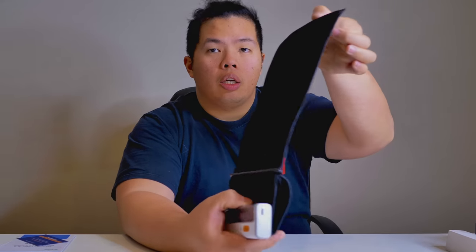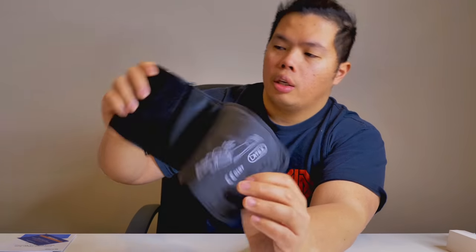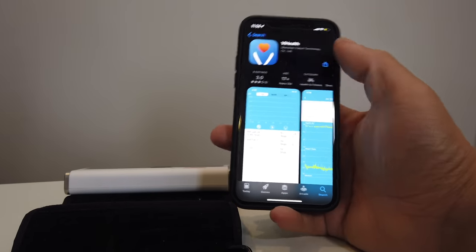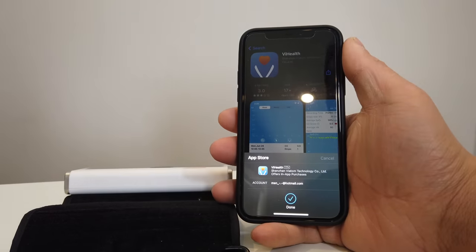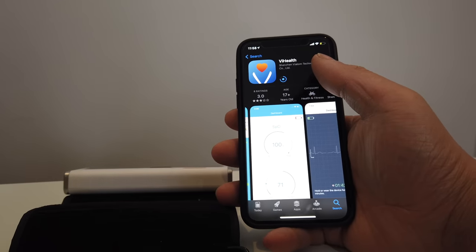As you can see, it looks like a normal blood pressure monitor, but of course this one is digital. We're going to download the app — it's called ViHealth. Go ahead and download that. This app is the way that we can track our readings from the Welllu blood pressure monitor.